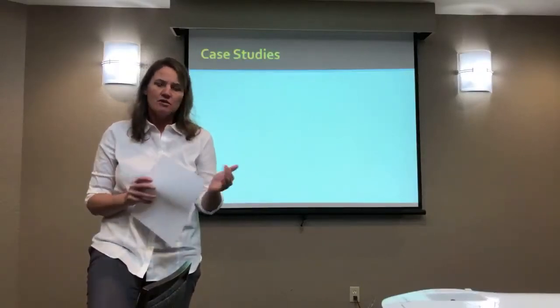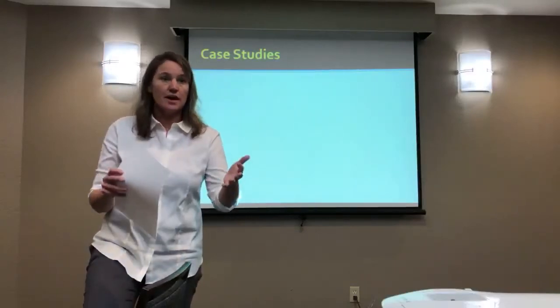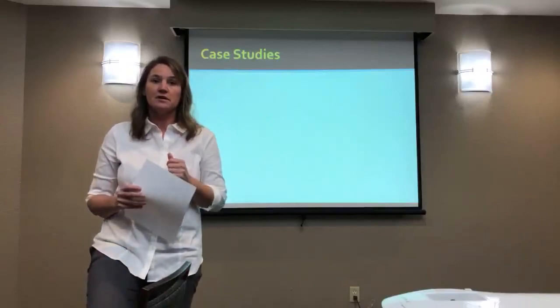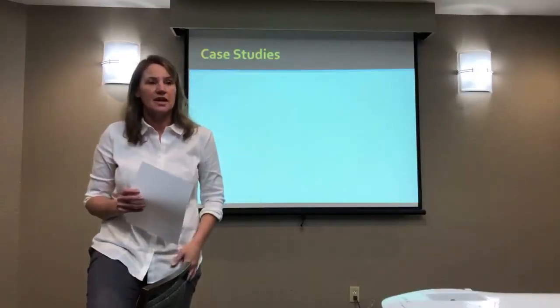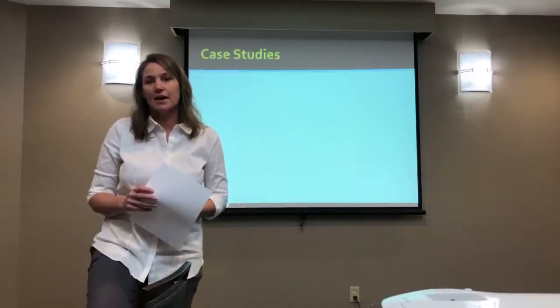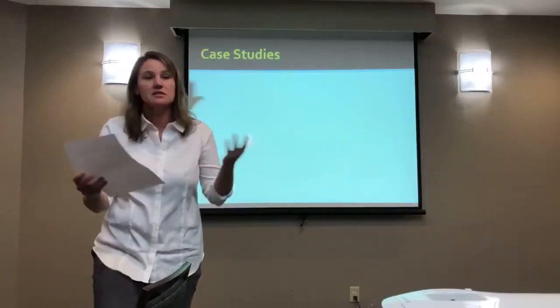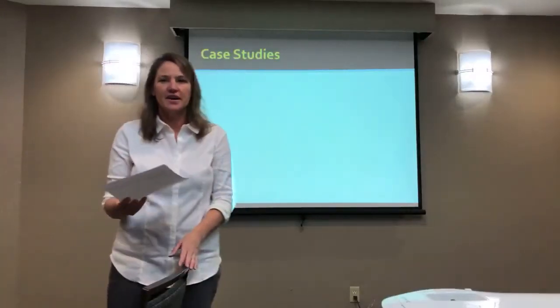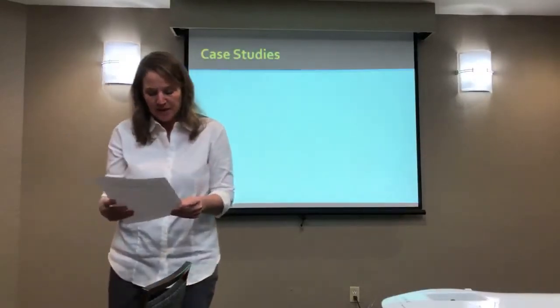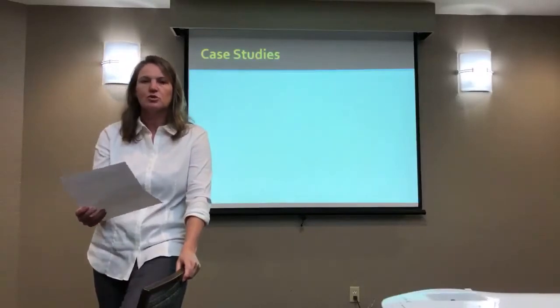But the longer someone sits around, they are going to be impaired by it, and every day that goes by there's a big repercussion. That's the person I would say, absolutely, I'm going to try it, because I want that possibility of getting them walking and healed as quickly as possible. So that's the reason I would justify it in that situation. Make sense? Yep. Okay. Next one, shoulder contracture, so frozen shoulder.